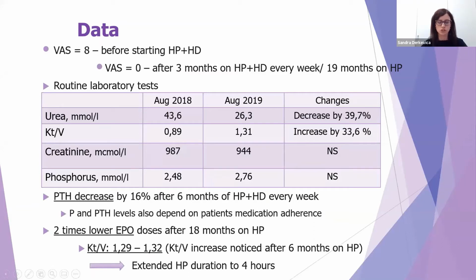We performed routine laboratory tests, and there was a decrease in urea concentration and an increase in Kt/V 1 year after hemoperfusion was started.